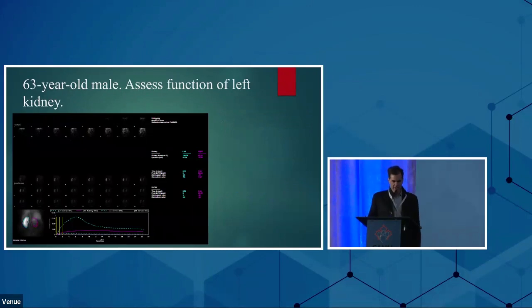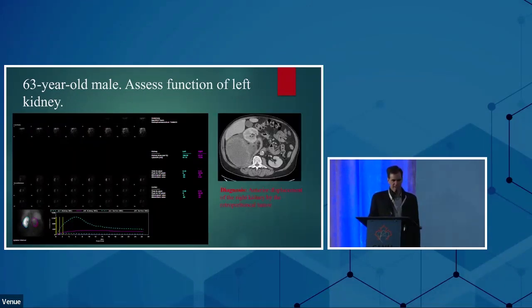Now, this is another patient who we did around the same time. The right kidney appears to be hypofunctioning, and the left kidney had 81% calculated split function, while the right had 19%. So, well, I look at the CT, and the right kidney is displaced anteriorly, which is a frequent cause of underestimation of the differential renal function.